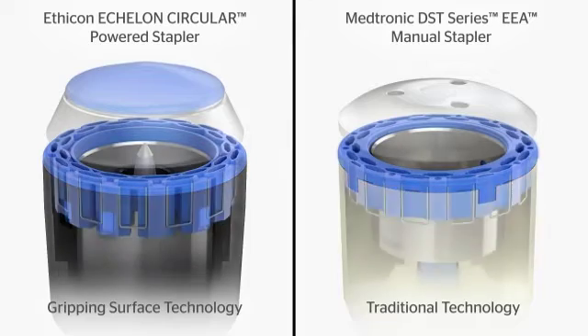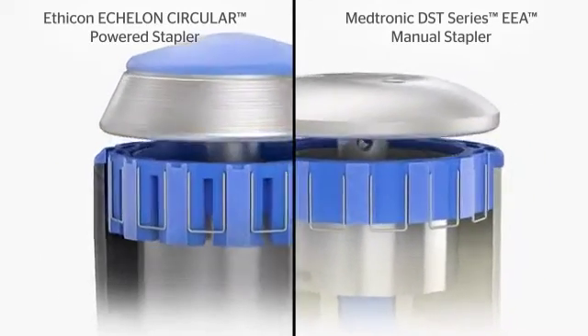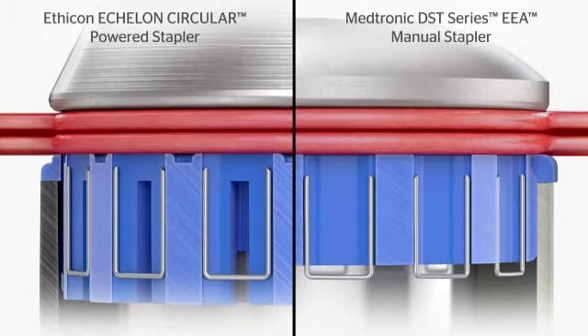Gripping surface technology gives you precise compression only where it is needed to prepare the tissue for staple formation. With this technology, the Echelon Circular powered stapler provides gentler handling and significantly reduces compressive forces on tissue.